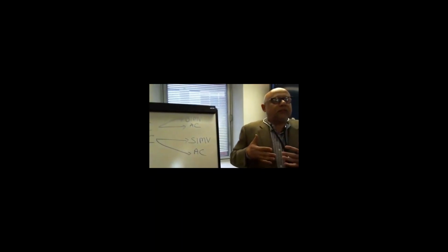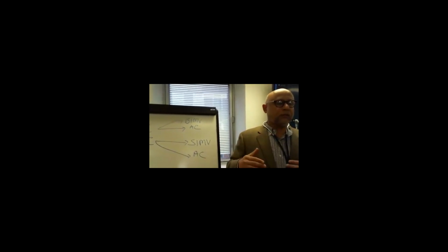So they have to work. The machine won't give these extra breaths. To make it easy, or rather to make things more complicated, we add pressure support. So when they do the spontaneous breathing, the pressure support decreases the resistance of the tube. Just remember the number: if you have to put the pressure support, put 8. If it's 8, you're fine. You can go up on it depending upon what tidal volume you're getting.